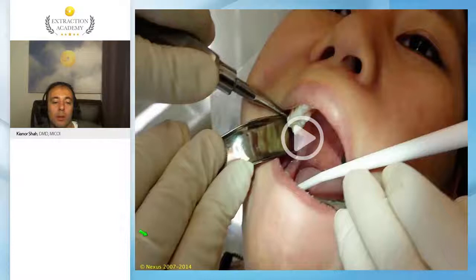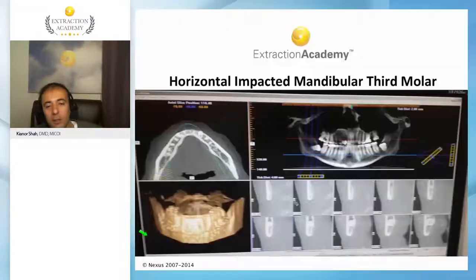At the academy. So simple, as you've seen, the maxillary third molars with the rolling motion out of the tooth. CT scanning. In this case, again, this is a good case where you can see where the molar is causing some trouble here on the second molar. You have essentially a complete horizontal impaction, almost a complete horizontal impaction, still a little mesioangular.